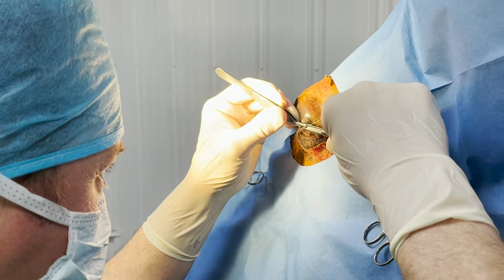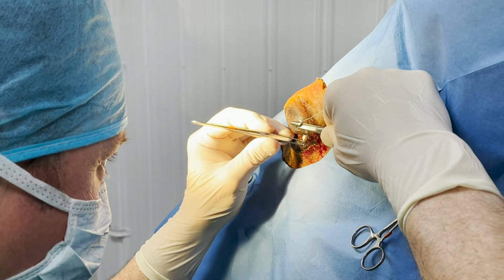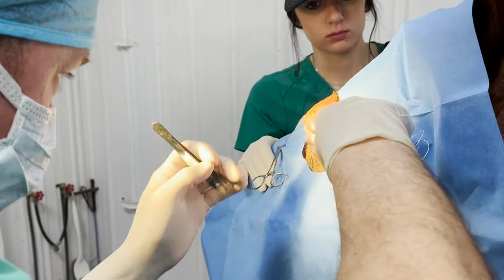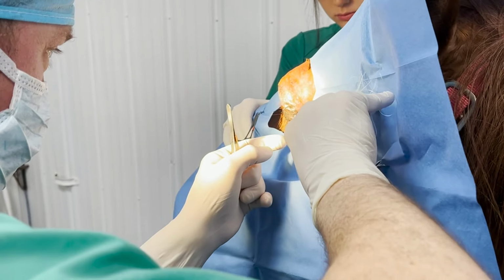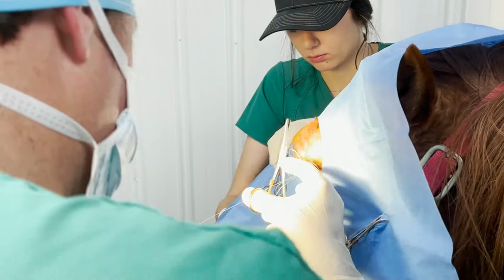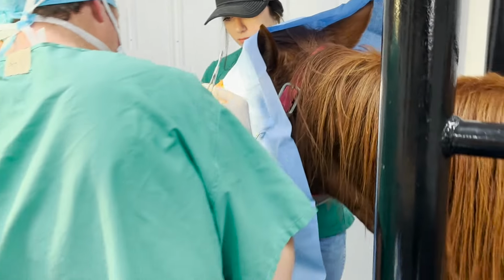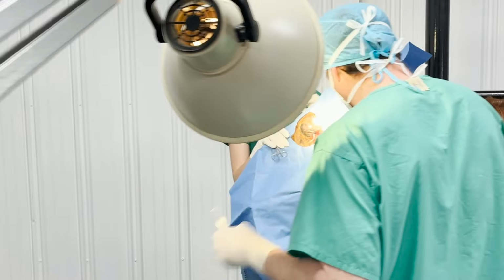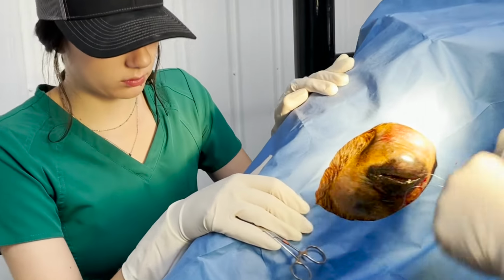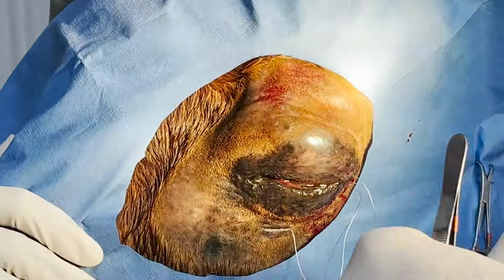So the first step in the surgery for this technique is to sew the eyelid shut, basically. We'll sew it shut, and I'll leave tails on that suture. That'll give us a little bit of handles, which you'll see later in the video why we have those. And then we'll actually be cutting through the eyelid to get back to the structures, and that kind of protects the eye.